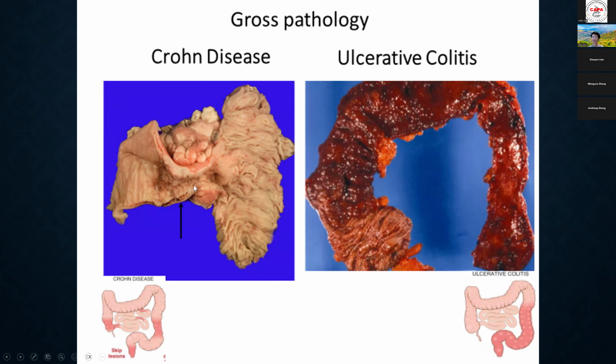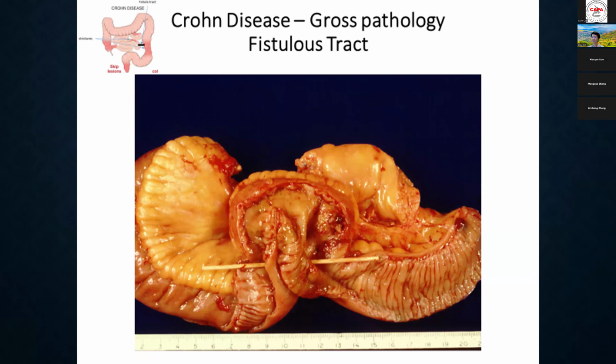Okay, so we can easily identify a linear ulcer. We see wall thickening, and there's a hole. It's probably a fistula, and then you can see there's creeping fat outside. And you can see continuous erythema and ulceration involving the distal and mid colon, and then the right colon may still be normal. And here you can see a fistula connecting to a segment of bowel. That's called the fistula tract.